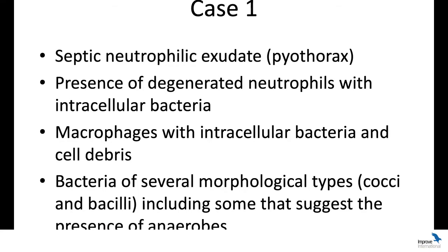Obviously, in a pyothorax, you would always consider the possibility of anaerobes being present, but it's a good idea to consider that when we see that type of morphology elsewhere. So that was case number 1.